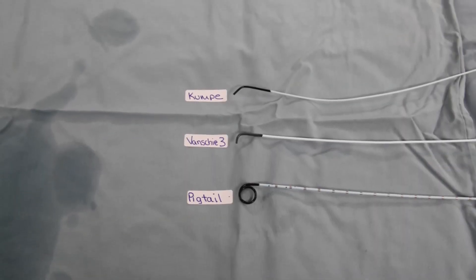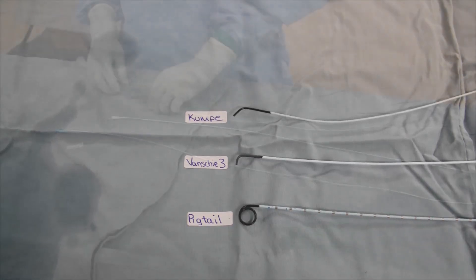The fifth step is to flush three types of catheters: the Kumpe, the Vanschie 3, and the Pigtail.